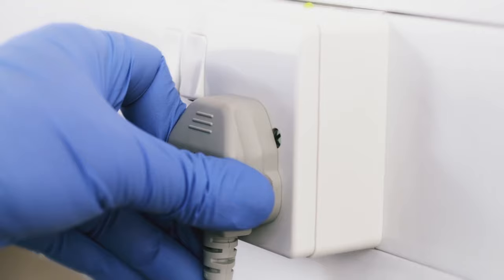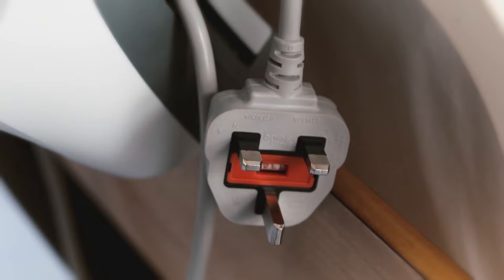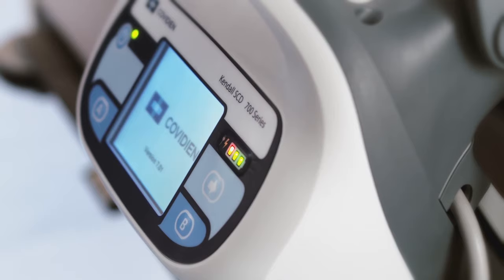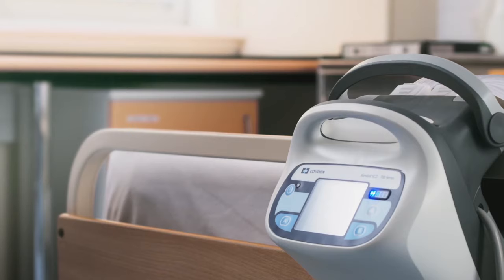Plug the controller power cord into a properly grounded socket. If no power supply is available, the controller has a battery that will provide the controller with up to 8 hours of power.